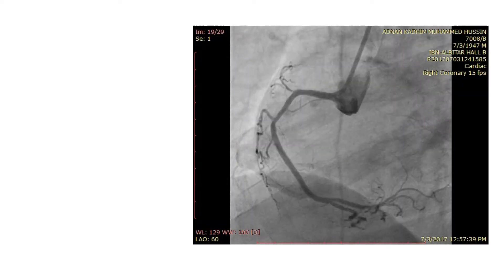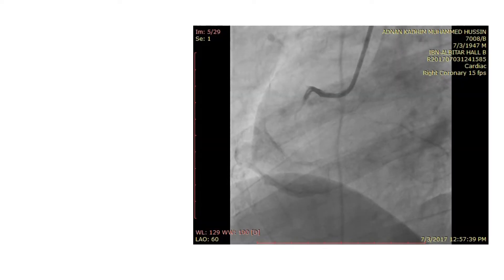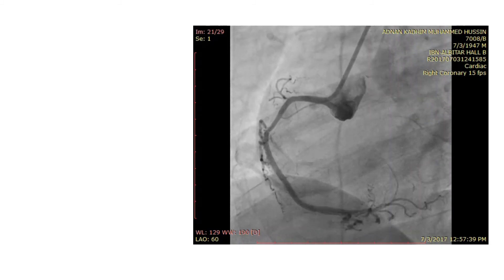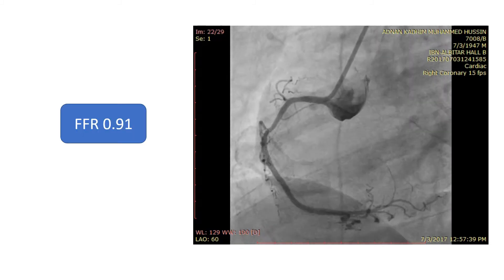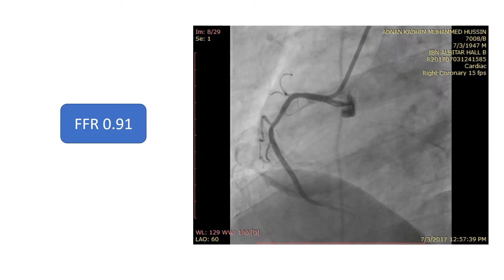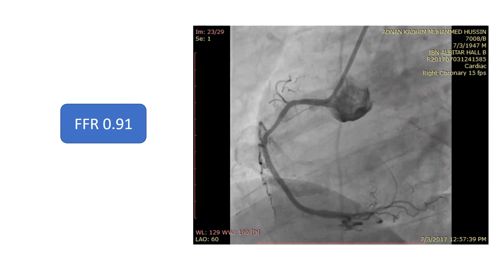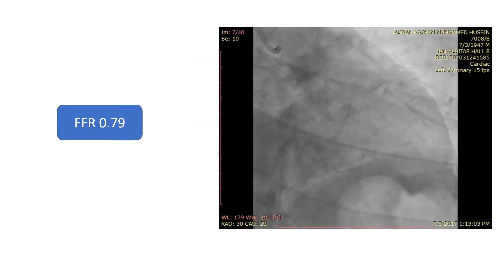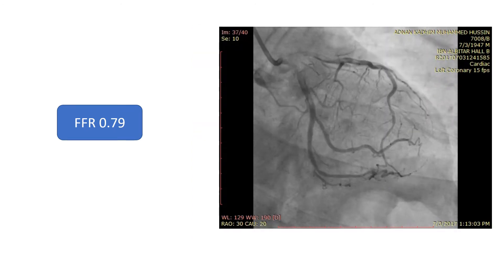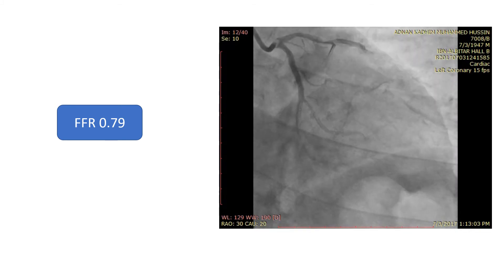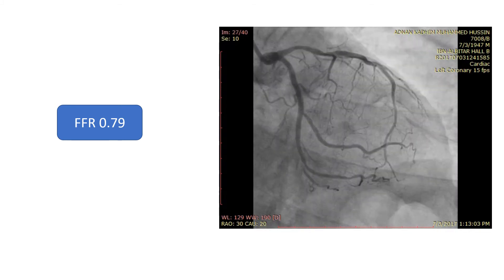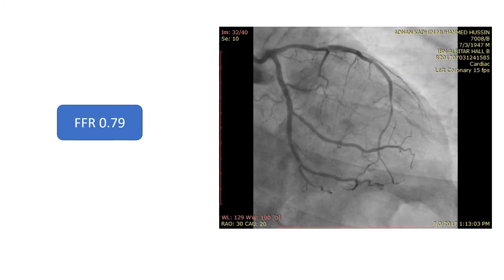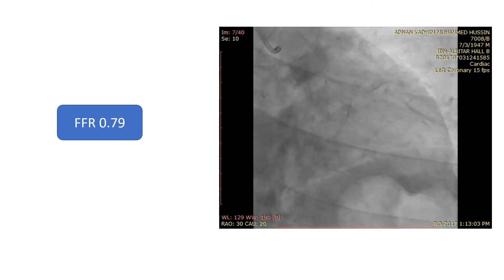We had an FFR system in our cath lab and decided to use it on both arteries. For the RCA, it was 0.9, which is clearly non-significant. And for the LAD, it was 0.79. Although it was significant, it was near the cutoff value.